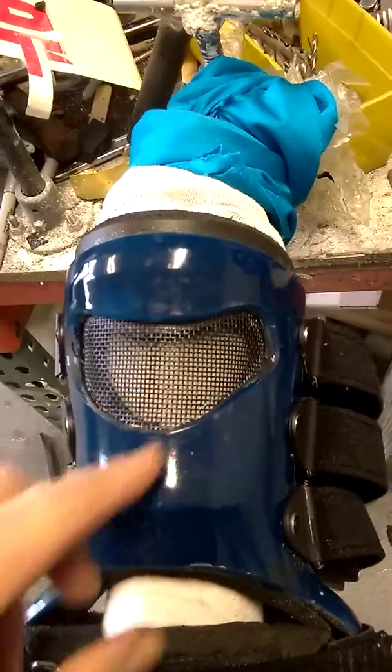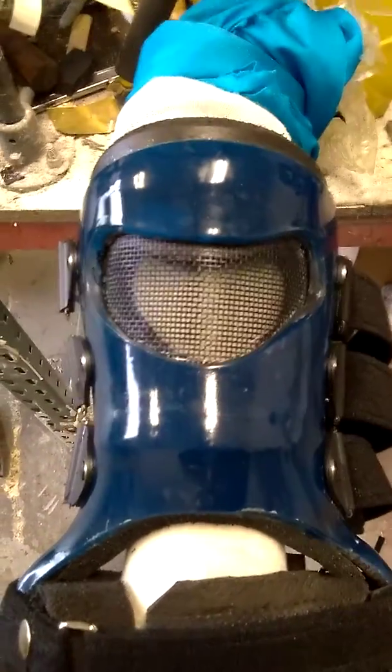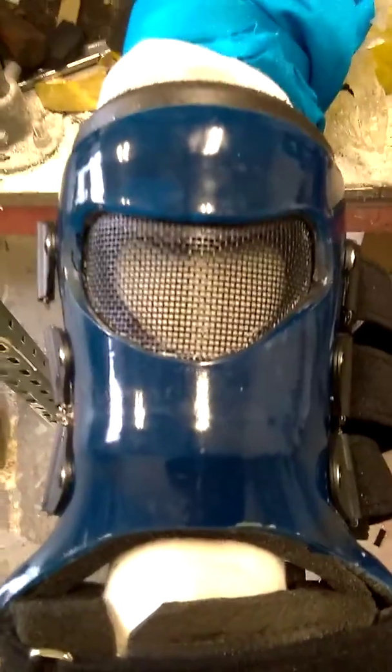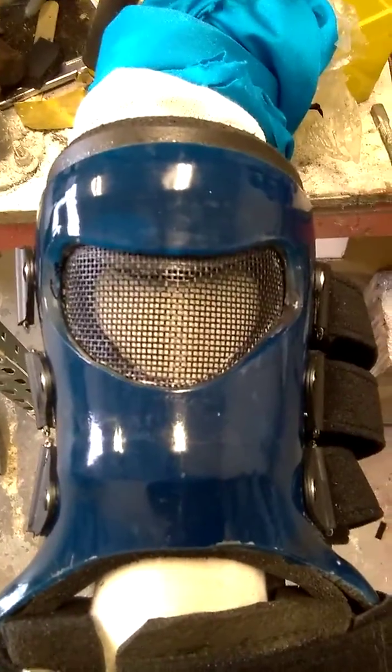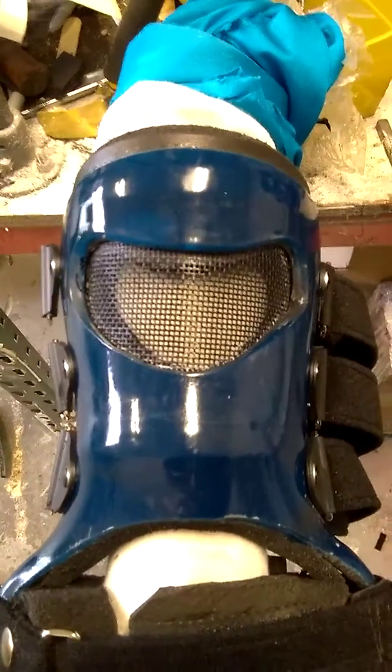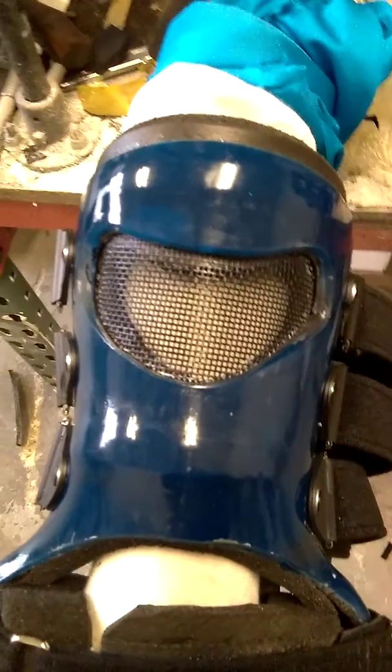Our new feature is a ventilation window on the upper part of the shell for the summer months when it's extremely warm. It helps with air circulation inside the area where the foam liner contacts the leg.